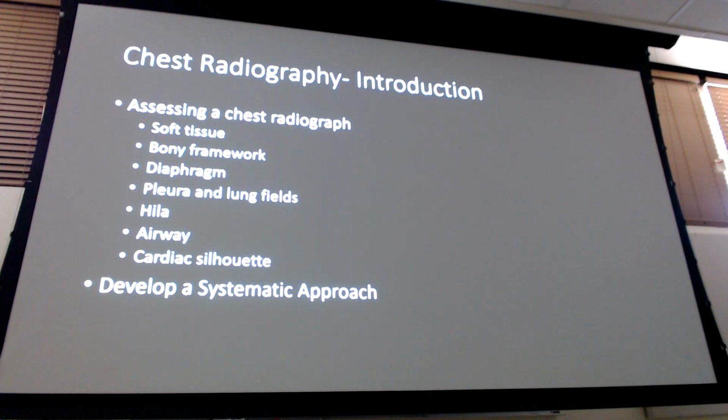So much like the bones, you need an approach. It's a little bit different, right? Here's the catch on this when you're doing a chest x-ray. What can't you ignore? The bones that you already learned how to look at, right? It's on the film, you have to look at it just to make sure you're not missing anything. But that falls in the bony framework.